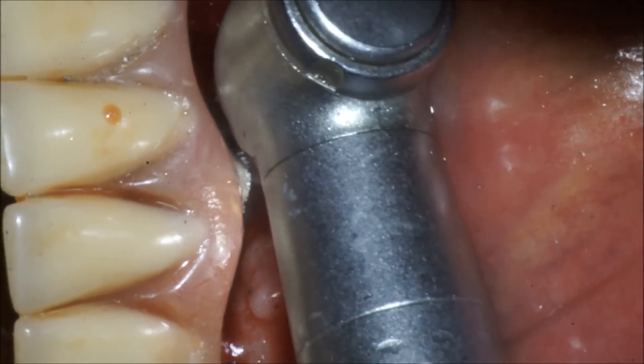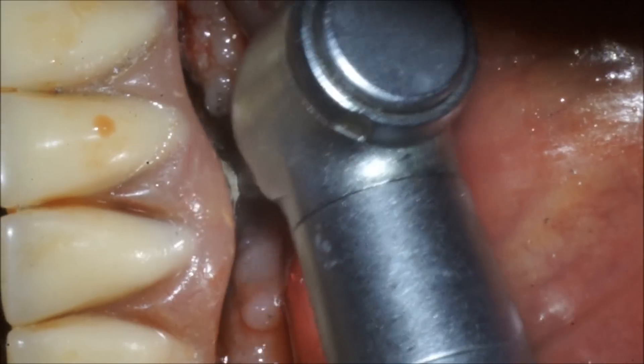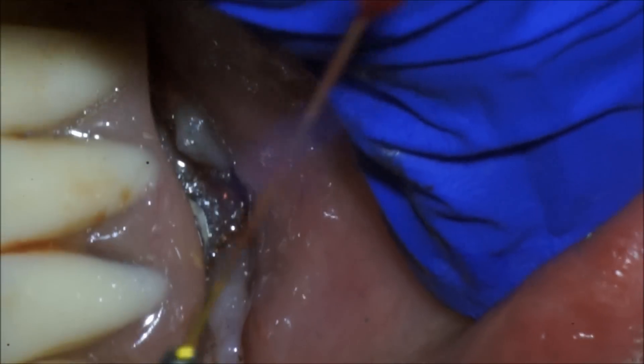We'll go back and polish the end of that abutment — or implant, whatever's left — and then come back and use our hemostasis setting, which is about 550 microseconds at about 4.4 watts, to go down and clean that site.